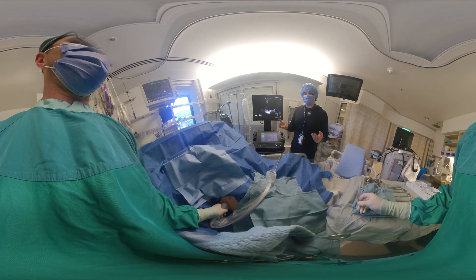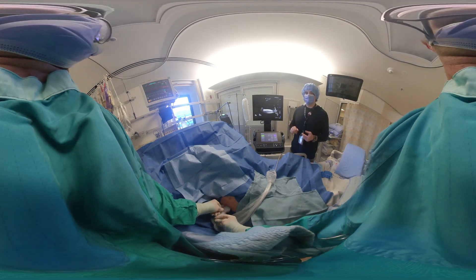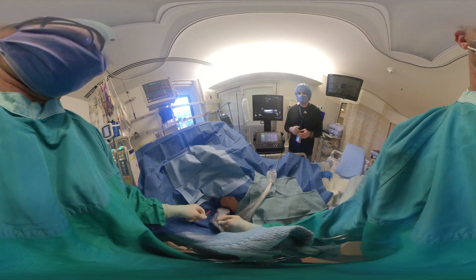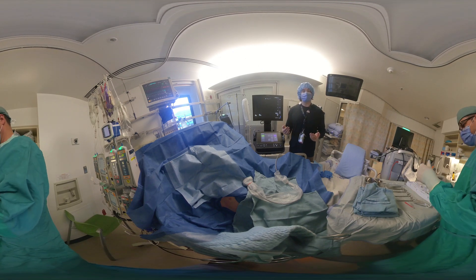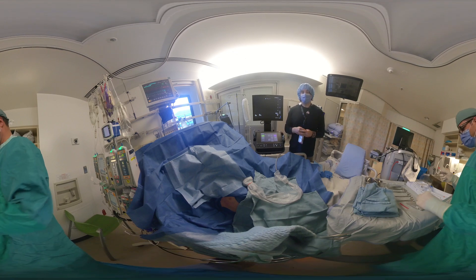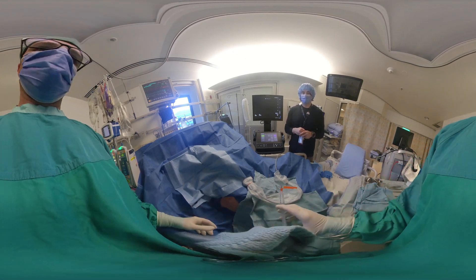We are using ultrasound guidance here, but this is called static guidance — where we've made a mark in advance of the procedure — versus dynamic guidance, where we watch the needle go in. I generally advocate for static guidance, as I believe it is safe and appropriate for most skilled practitioners.